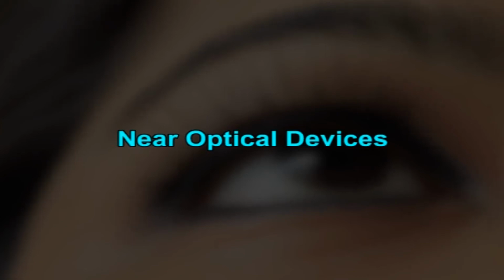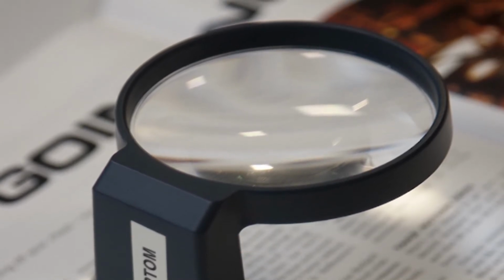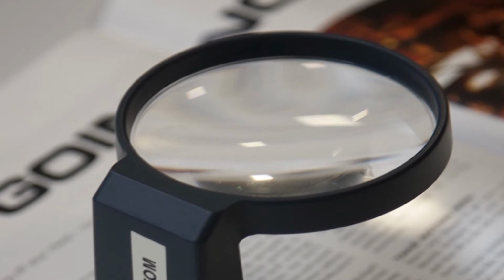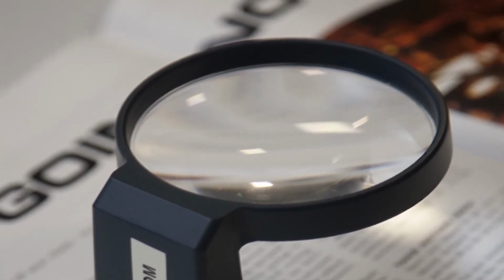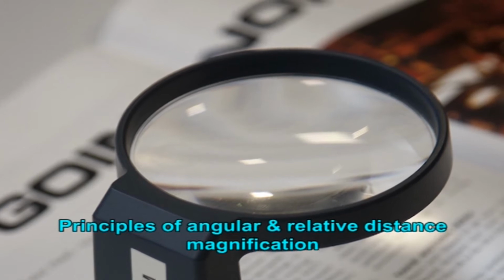Near optical devices. The most common devices in this category include stand magnifiers. The simplest device for reading is the stand magnifier. When placed on the page, this type of magnifier is automatically in focus for reading. A stand magnifier is basically a plus lens mounted on legs that fix the distance from the lens to the object. They work based on the principles of angular and relative distance magnification.